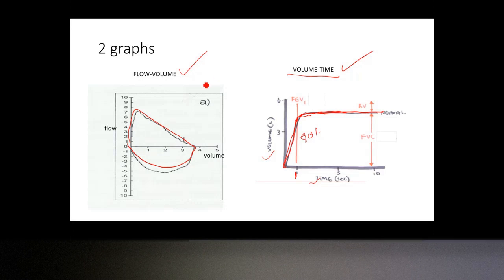Stelios, your question is to find peak PEF. Yes, on these graphs. Okay. Guys? It's 7. Sorry? 7. I do not get 7. Yes, exactly. PEF is 7. What about FEV1?